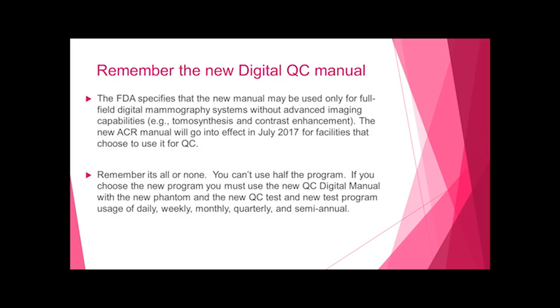Remember the new digital QC manual? The FDA specifies that the new manual may be used only for full-field digital mammography systems without advanced imaging capabilities like tomosynthesis or contrast enhancement modes. The new ACR manual will go into effect July 2017 for facilities that choose to use it for their quality control program. So remember, it's all or none. You can't use half the program.